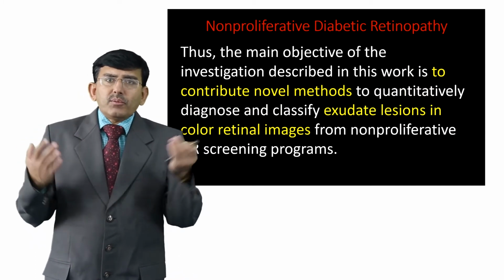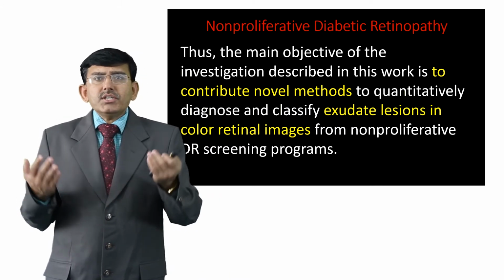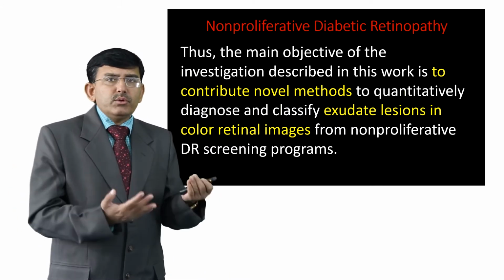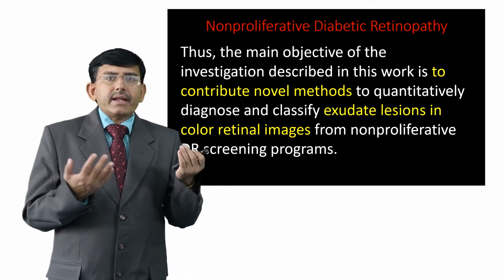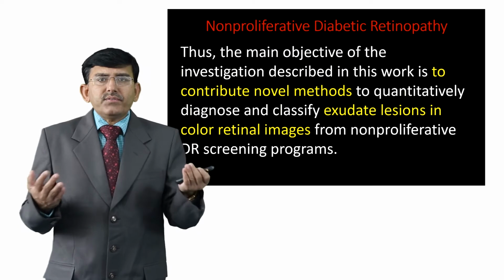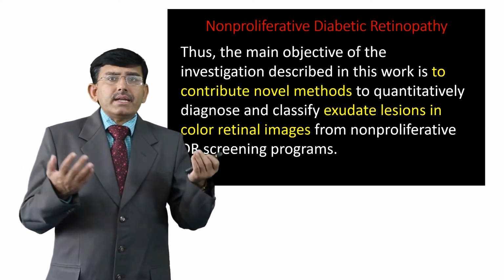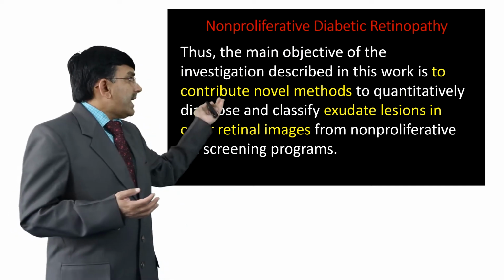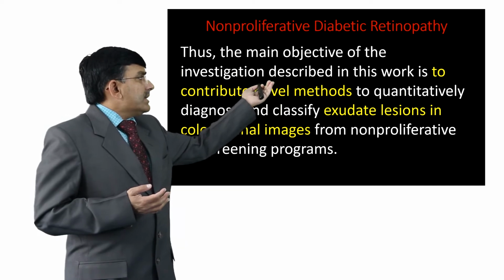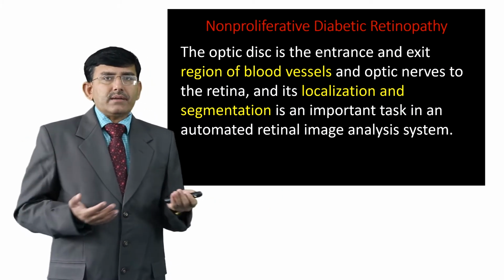Thus, the main objective of the investigation described in this work is to contribute novel methods to quantitatively diagnose and classify exudate lesions in color retinal images from non-proliferative diabetic retinopathy screening programs performed for society.